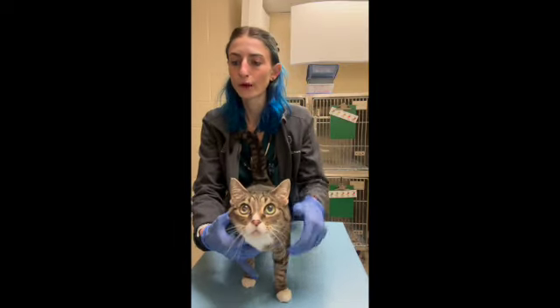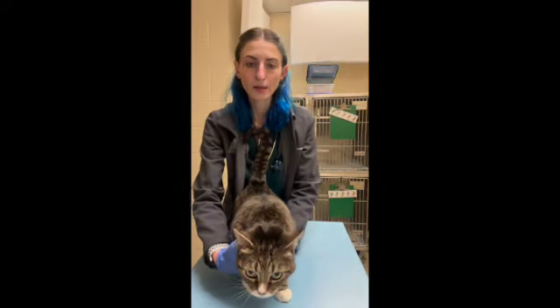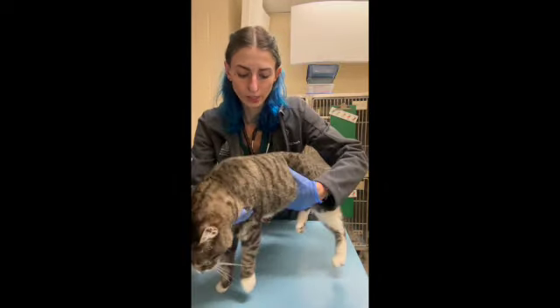And then for a saphenous blood draw for felines, we typically go for the medial saphenous. And so we're going to put our patient in lateral recumbency.